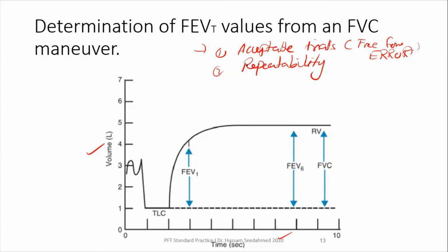Then, are they repeatable between the two largest? If they are repeatable, then you should calculate from the largest. We don't get the average, we calculate from the largest.